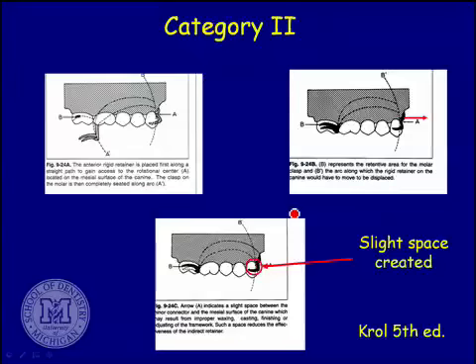Okay, we look at basically a category 2. Sometimes in these situations, if you would imagine this to have anterior teeth set out in the front, and that again is the picture on the front of your manual. And so what would happen in these situations is, as it was being seated in, the front part seated first, the end of the flange would sort of fit up in here, but the rest seats themselves would not fully be seated. So we angle it in on this forward angulation this way, seat the flange in, start rocking it down, and as it's rocking down to place, later on then the front rest seats come to rest, and then last of all, the back rest seats come to rest.